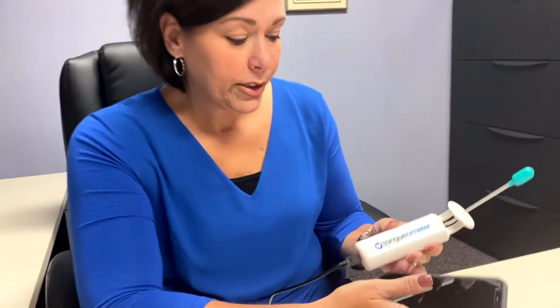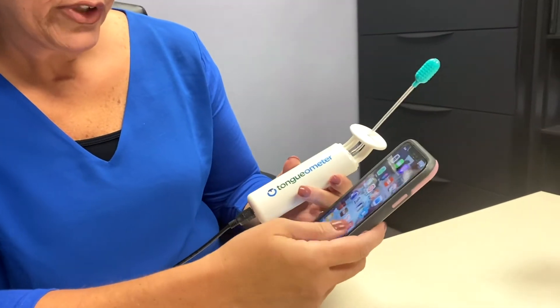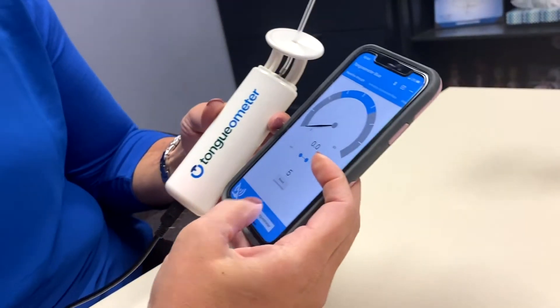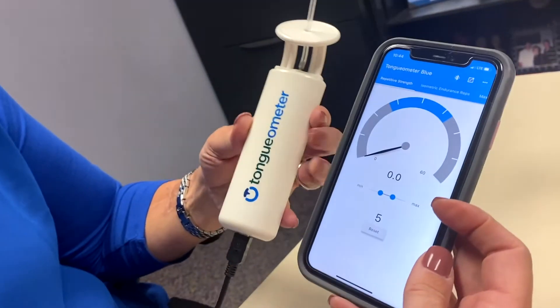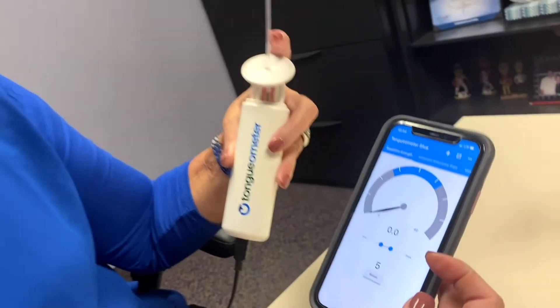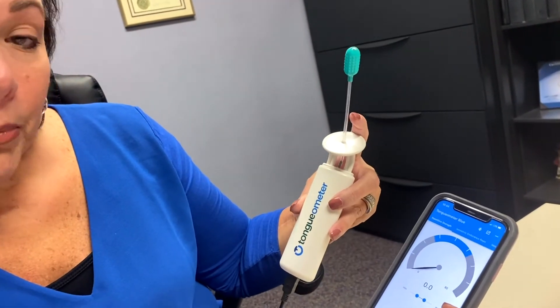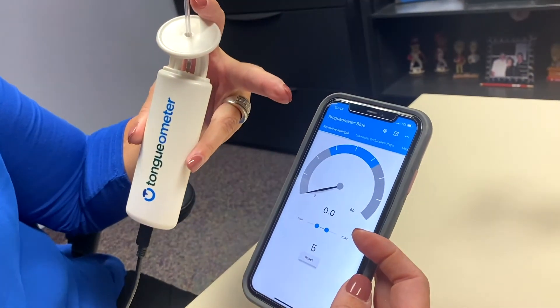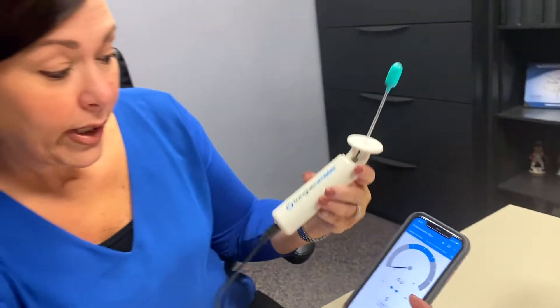Let me go ahead and show you how the device works. You put the app on your phone — it's called the Tongometer app — and connect to the Tongometer to let it all sync. Then you put the bulb inside your mouth, place it on your tongue, lift it up to the roof of your mouth, and apply pressure. The goal is to be at least in the blue range so that you know you're getting into a good range.